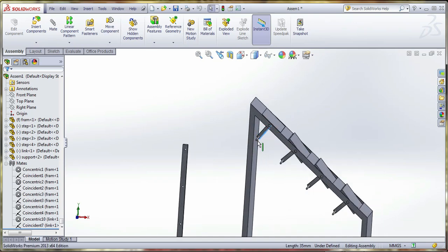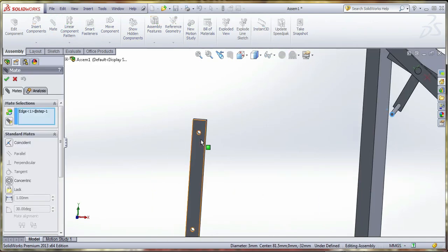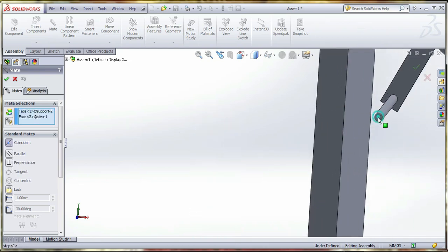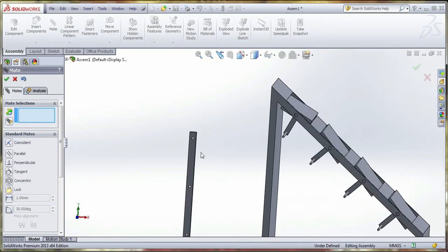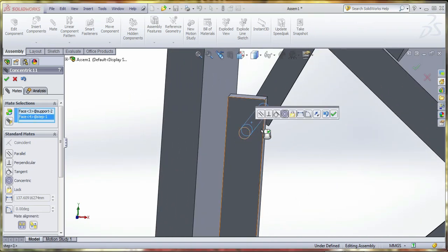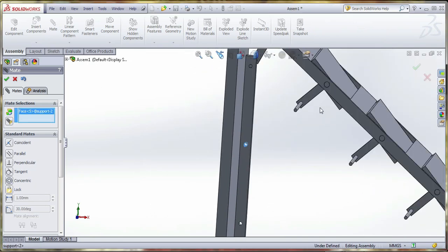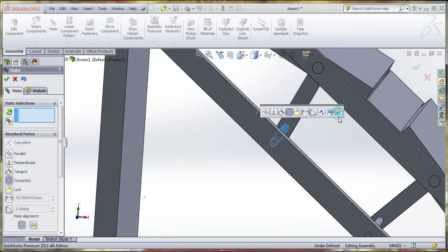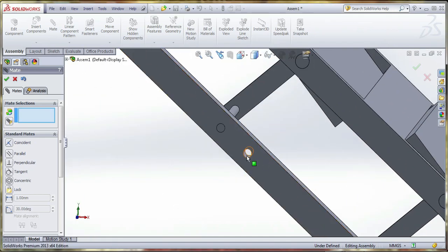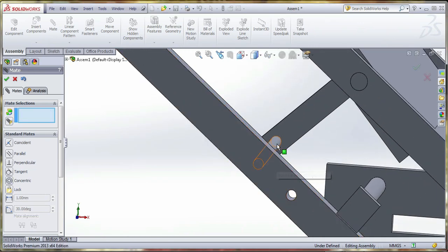Okay, select internal surface of the support. First we're going to mate, and select internal surface of the support and external surface of the step. The same thing, and mate, internal surface, external surface, and the same one.